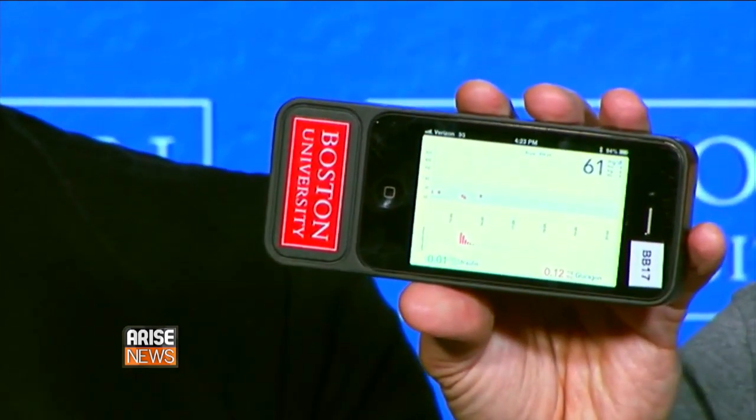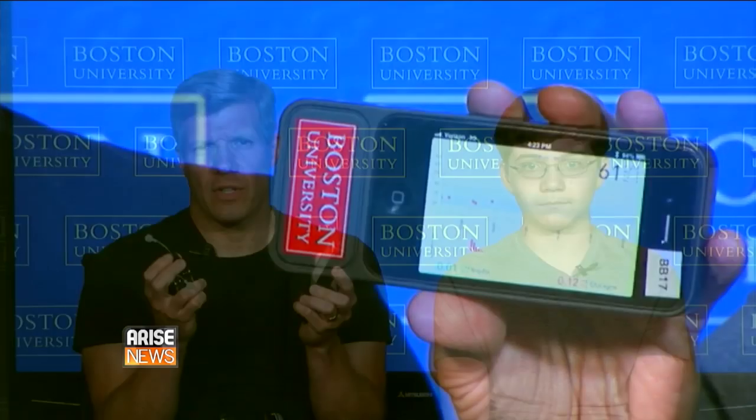And this system, which is a little cumbersome in its current incarnation, is a device which you wear on your belt or in your pocket, and it automatically makes all the decisions for you to manage your blood sugar. Day in and day out, 288 decisions a day, 7 days a week, 365 days a year. So basically it takes care of people with type 1 diabetes without them having the constant wear and tear of thinking about their blood sugars every single day.